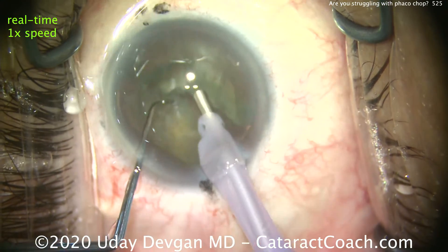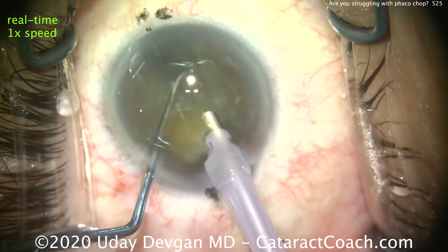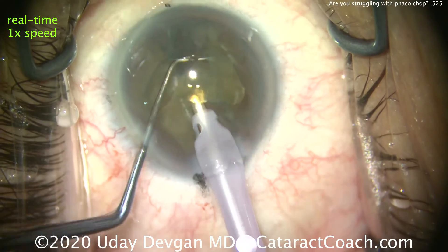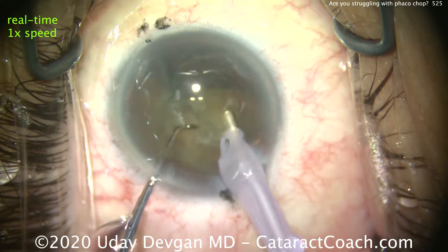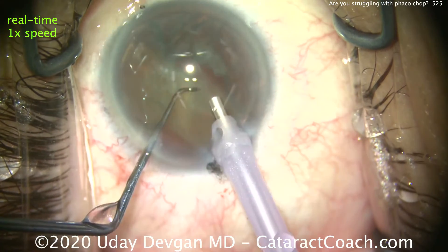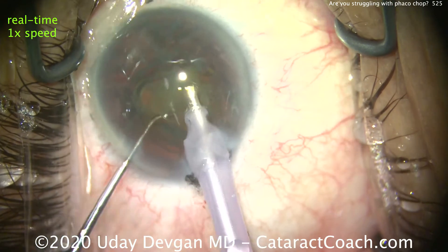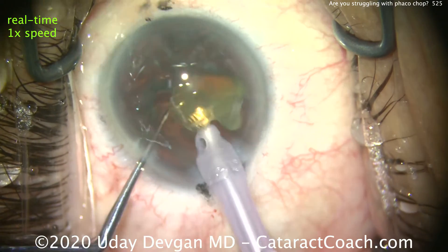Once I'm sure of it, buzz the FACO probe in, bring out one corner of the nucleus, chop it, buzz that little quadrant down. The chopper is being used to push the piece in front of the tip. Buzz into the remainder of the first half, bring it up — no further sub-chopping required. Simply push the piece in front of the probe, buzz into the second half, bring it up, chop. Remove that first quadrant and then get the remainder of the second half. Just like that.